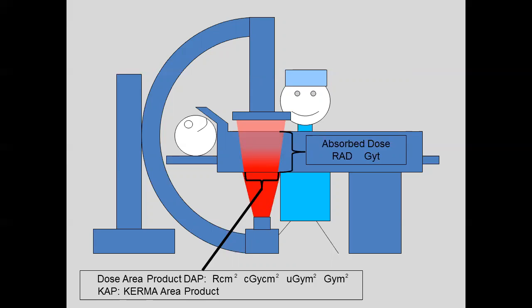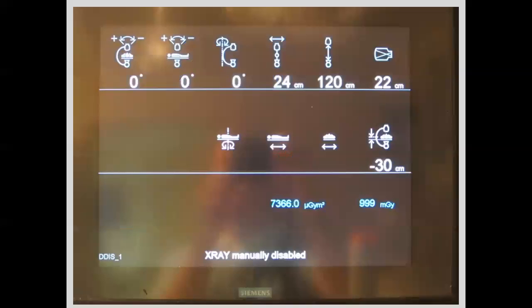So if you ever see a cumulative dose of 10 gray, looking into the backscatter factor, if you stayed in the same angle the whole time, you could have up to 15 gray of radiation to that one spot because of that backscatter, okay? So that's something to be considerate of. That's why at the VA, if we get above 10 gray or more, I report it to the RSO for an investigation. Now, I've done it 4 times in the last year. You know, once we say we use multiple angles, nothing there, but at least when JACO comes, we have that, we've reported some, we've investigated. Okay. So that's backscatter factor.